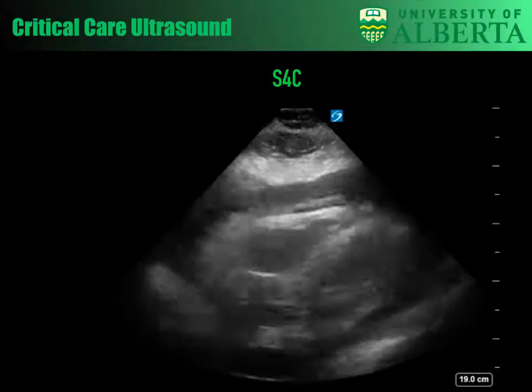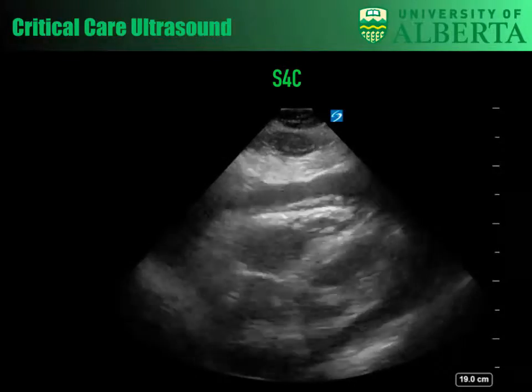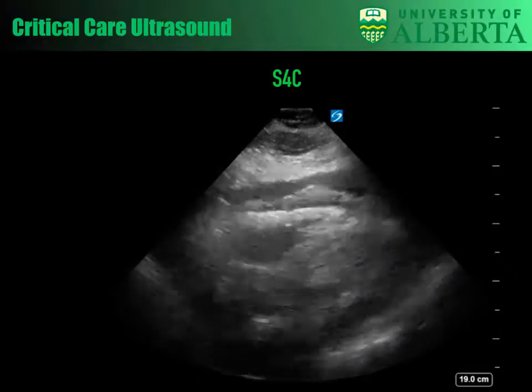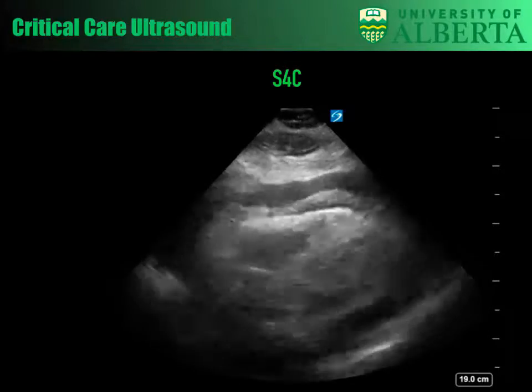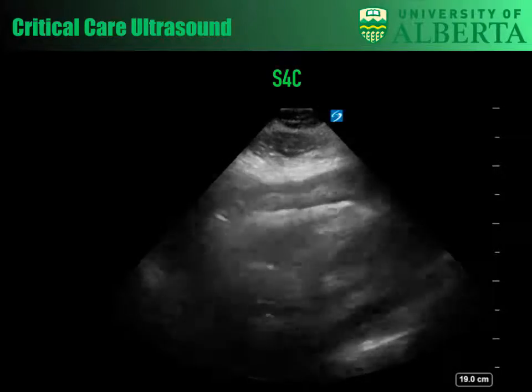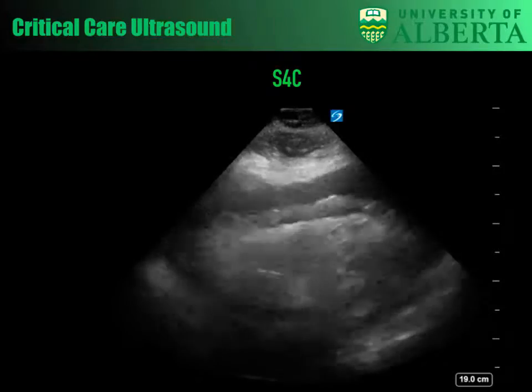So for the heart, this would be the LV. That'd be the RV. And this is probably mostly collapsed, at a fat. It also could be a malignancy, but we think it's fat. For this lady at the time, it was difficult to separate, and she was obviously in extremis. But so we see this large effusion. The RV, we can't see the RA very well.